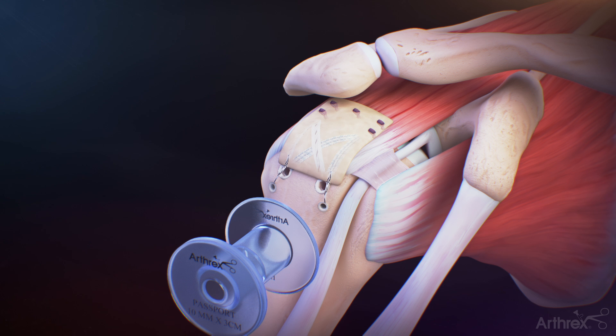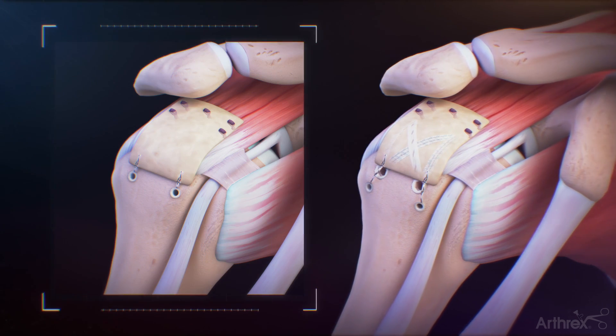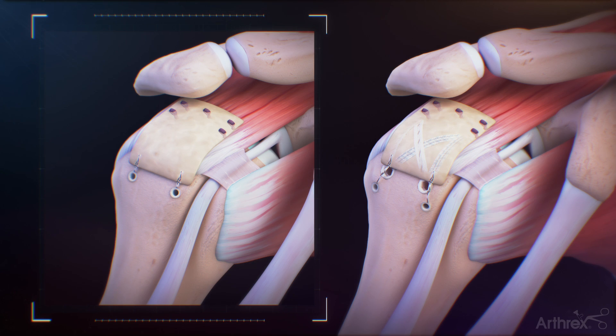Repeat for the second 3.5 mm pushlock suture anchor to complete fixation. The CuffMend system may also be used with partial thickness rotator cuff tears.